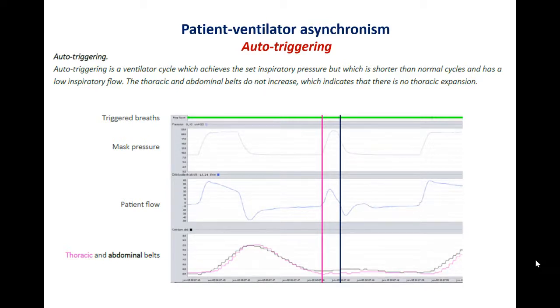Auto-triggering is finally a spontaneous ventilator cycle without any patient demand. So it may be related to a technical problem. It may be related to leaks, of course, too, and sometimes we have to change the machine.